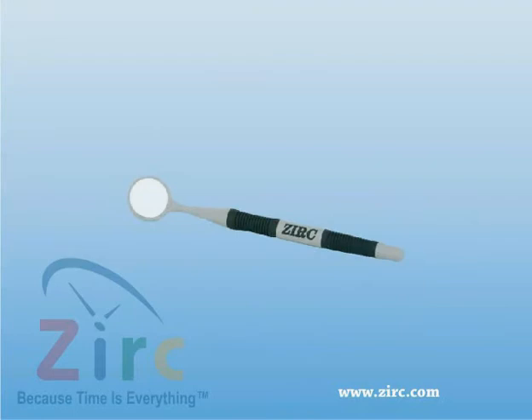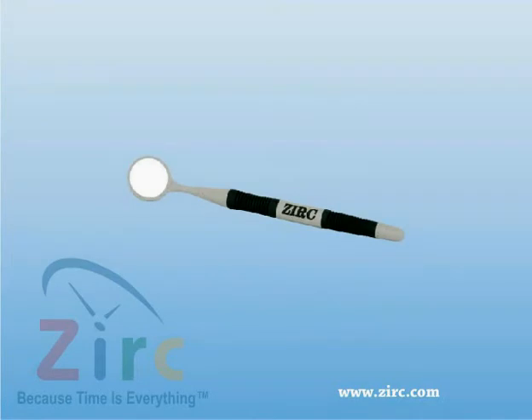It produces a brighter and clearer image than any other mouth mirror on the market, with 42 alternating layers of 3 different oxides.